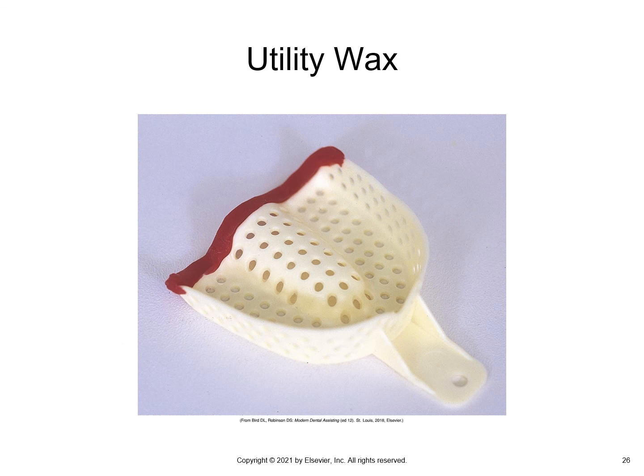This is an example of the utility wax. This happens to be red. In our clinic, ours is clear, and we use that to either extend our impression trays or to use along sharp edges of the impression trays and give us a little bit more anatomy up in the vestibular areas. So that is typically what we will use as hygienists.